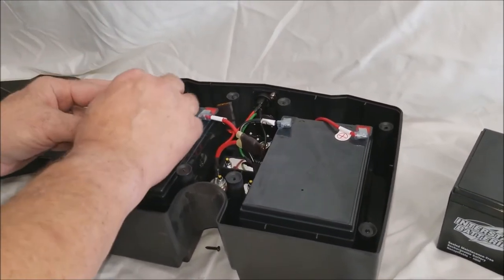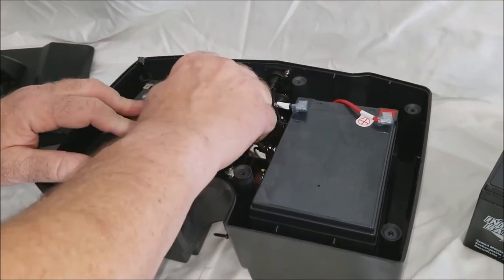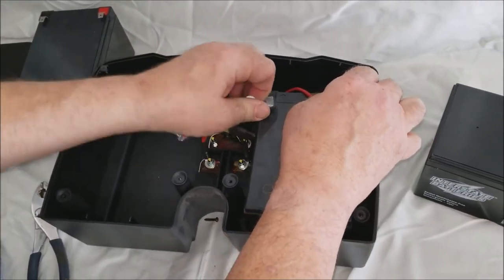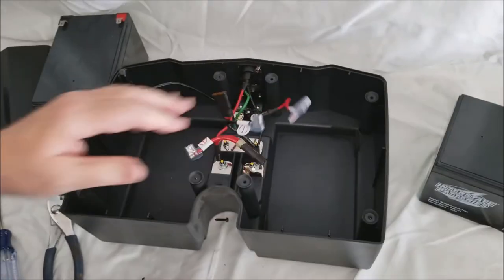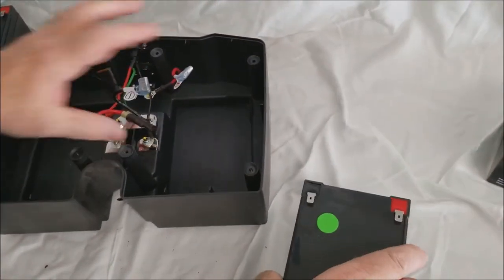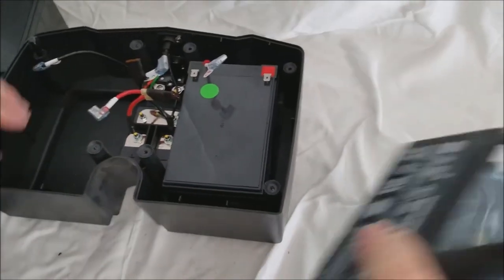And to replace them, we're just going to unplug these connectors, just like this. We're going to lift the battery out. We're going to take this one also. You don't want to mix up your batteries. Make sure you have the new ones separate from the old ones. We're going to take the new ones, put them in there.